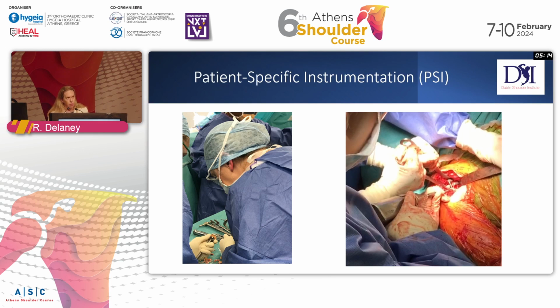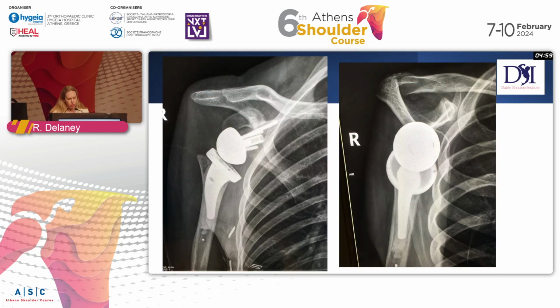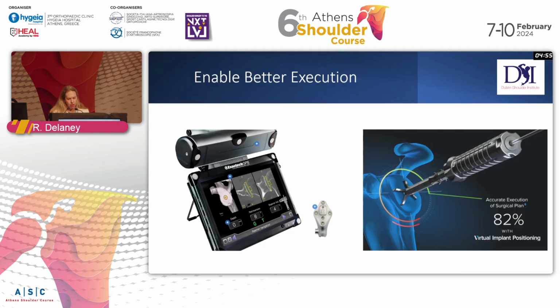We did look at whether we had more than 1 centimeter of post in native bone, and we did not, and therefore we staged it. So we did the hemi-reverse that George was talking about, but with the plan to go back and then do the humerus once the bone graft had incorporated. So at about 4 months after the first stage, we went ahead and did the second stage. And so pre-op planning really helped us with this case and made it less daunting.